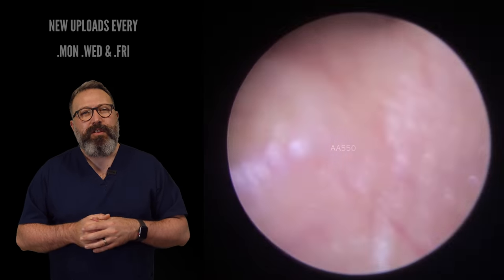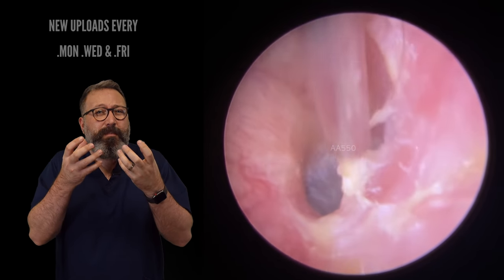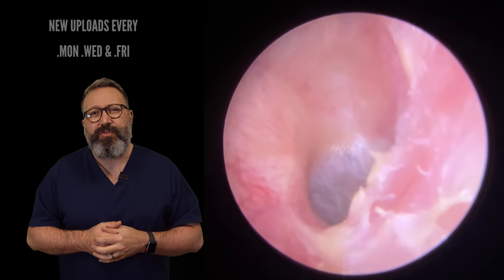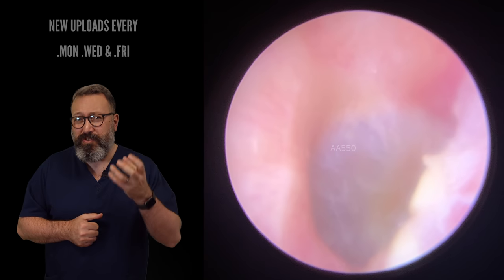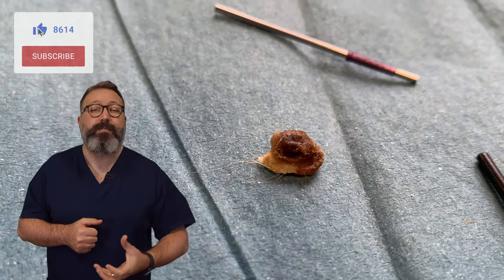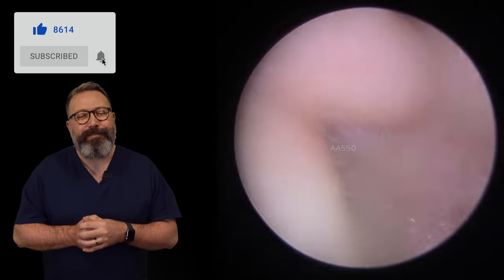We'll see the ear drum beyond. Look how the ear canal was really irritated — all the blood vessels have come to the surface. It's quite pink, quite aggravated in there as well. So we've taken a little bit of this dry skin away, but we don't want to pull too much because it's really tender in there. So my advice to this patient would be to keep that ear canal as dry as they possibly can for the next couple of days.